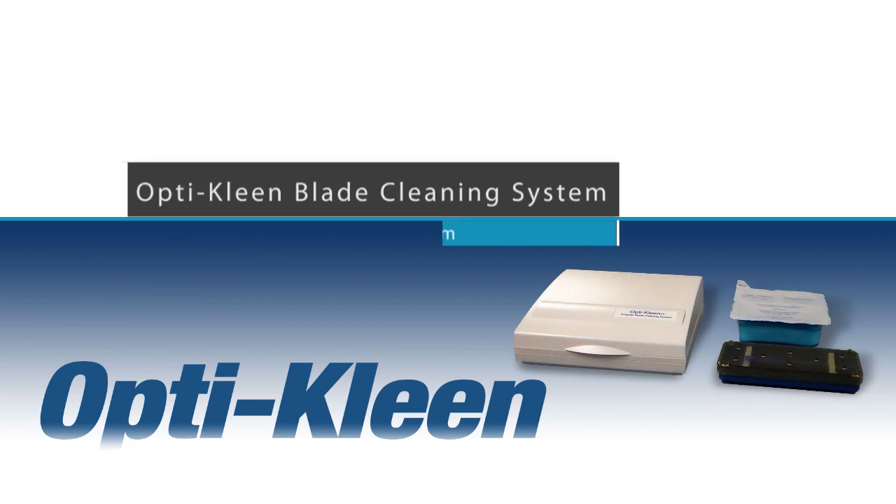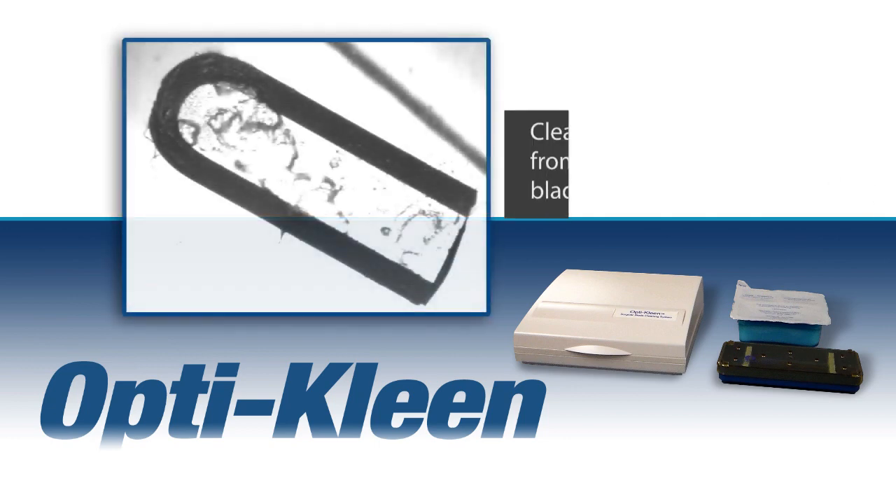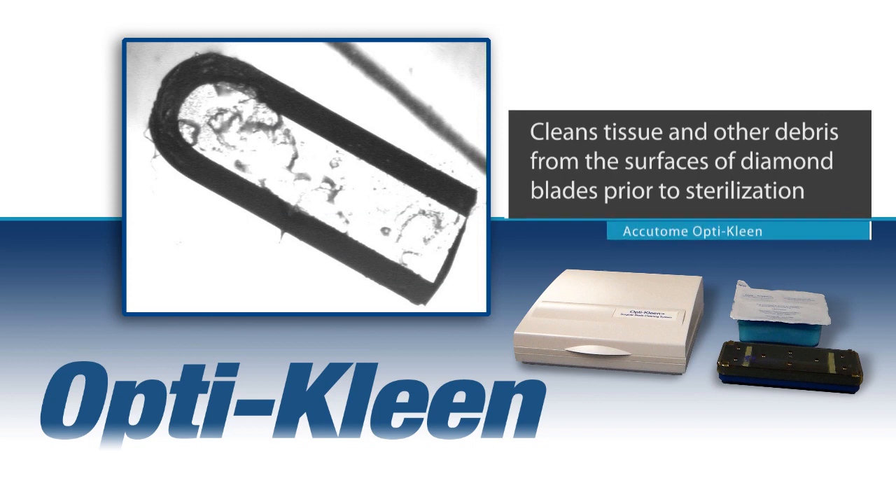Accutome recommends the OptiClean blade cleaning system for the care and cleaning of your diamond knife. This is an efficient and safe method for cleaning tissue and other debris from the surfaces of diamond knife blades prior to sterilization.